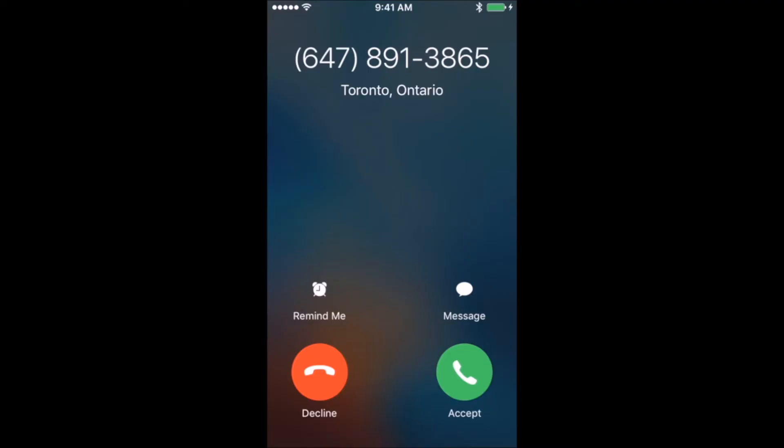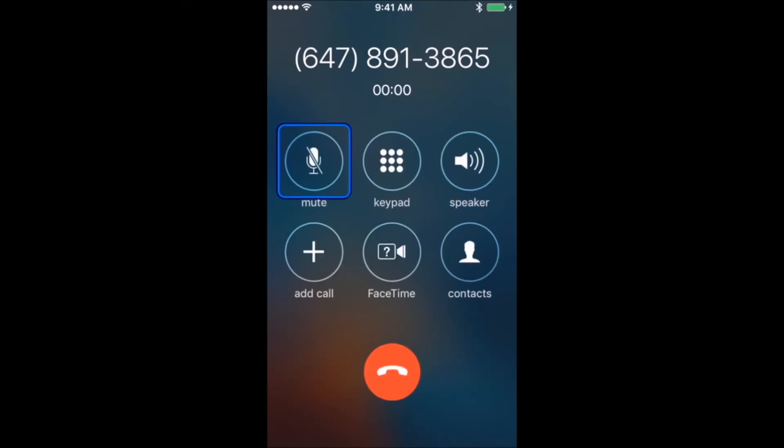To accept a call, wait until the scanner highlights the green answer icon and press your switch once. The in-call screen will automatically be scanned during the call, providing access to the mute icon, the keypad, and the speaker.